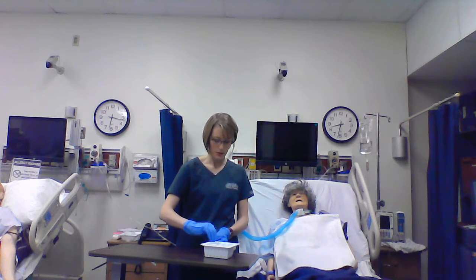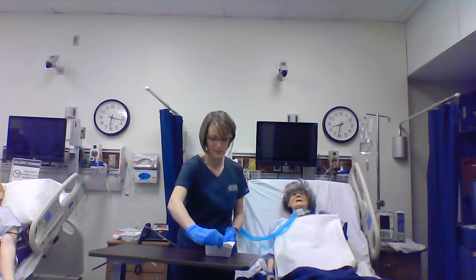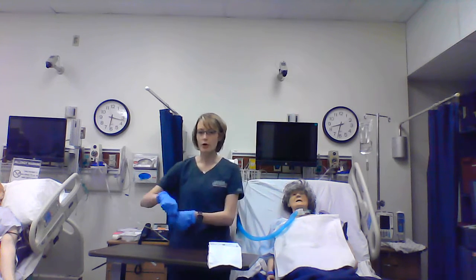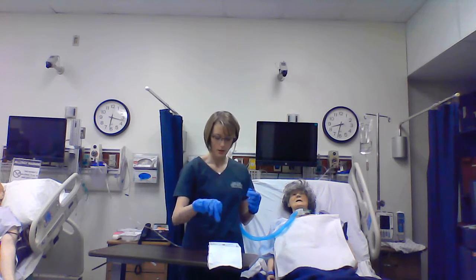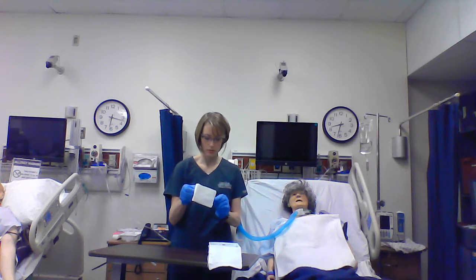But you're going to open this sterile kit, just like you did the catheter kit, opening it away from you. And then at this point, I would open another package of sterile gloves and don those, and then start pulling out catheter care kit material.